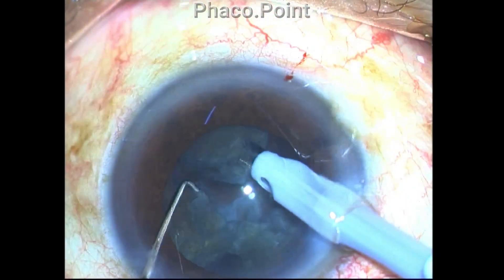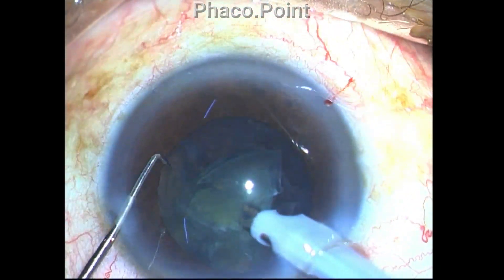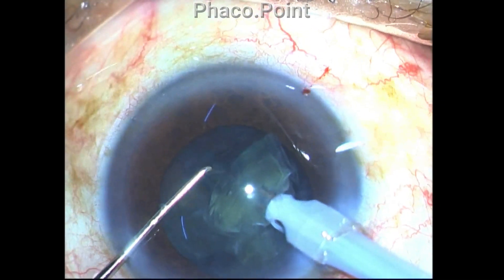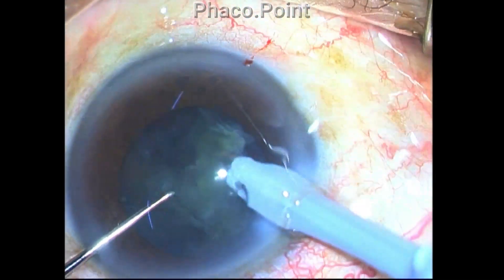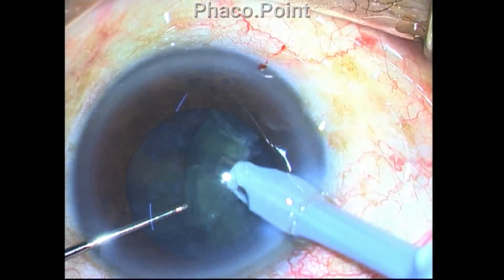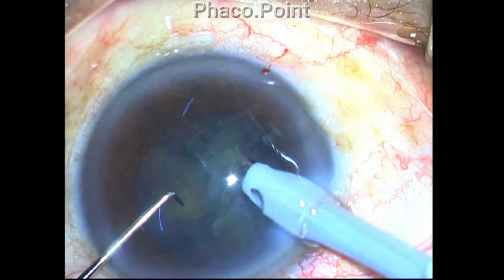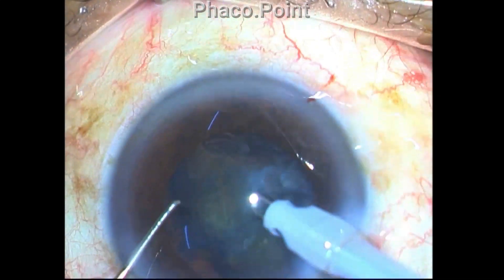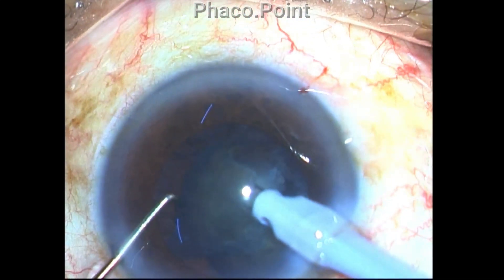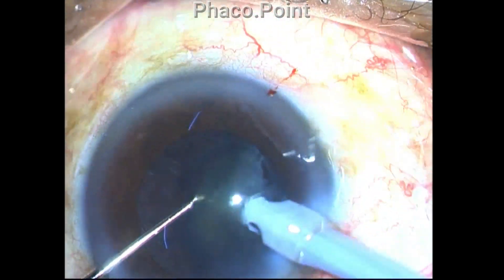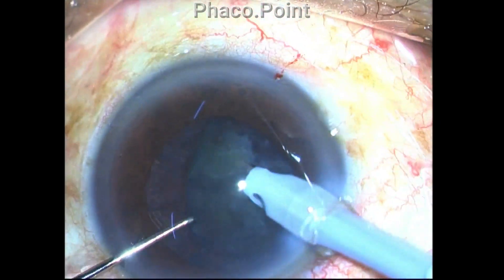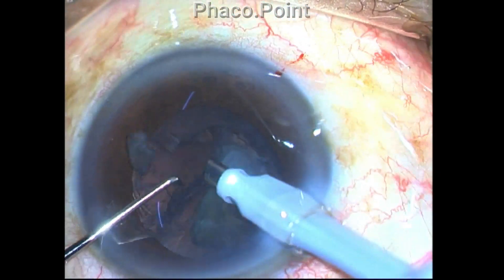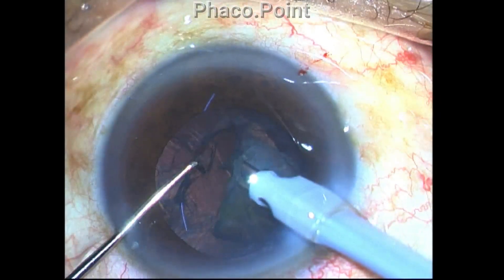I take care to see that I mobilize only one piece at a time in order to minimize the release of small bits of nucleus fragments that have a tendency to be carried by the fluid currents within the eye. This will greatly minimize the risk of getting endothelial damage by mechanical damage induced by the fragments.